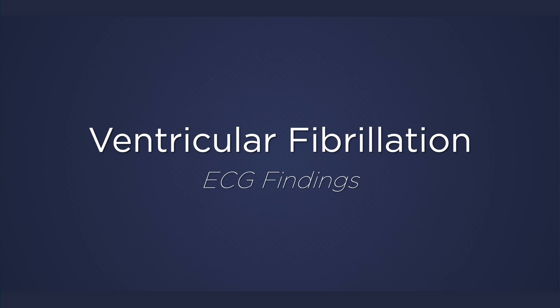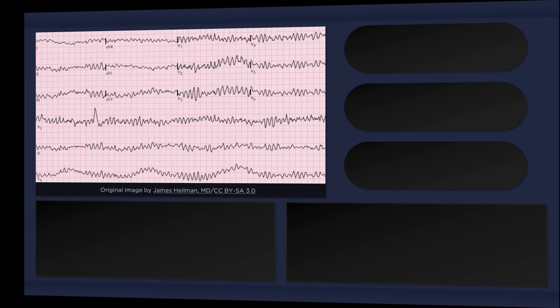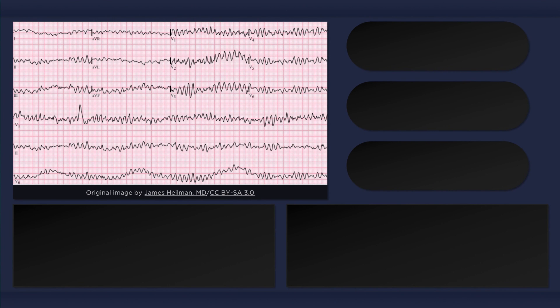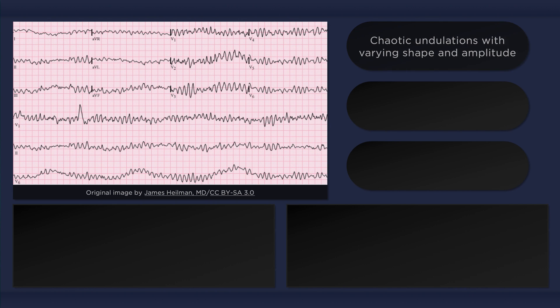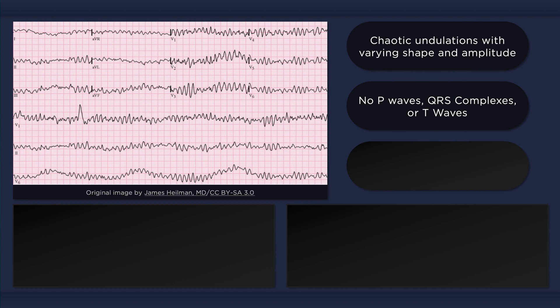Ventricular fibrillation — V-fib — is a chaotic rhythm without any discernible pattern. The rhythm consists of completely disorganized electrical activity with undulations of varying shape and amplitude. It's so chaotic that if you were to draw an illustration of it, chances are your sketch would actually be more organized. Essentially, the ECG just looks like a mess — there aren't any QRS complexes, P waves, or T waves.